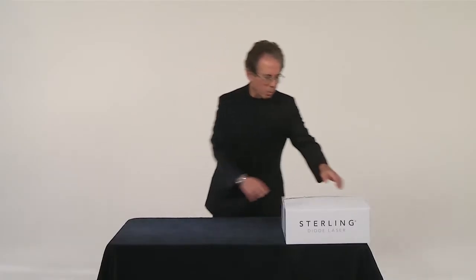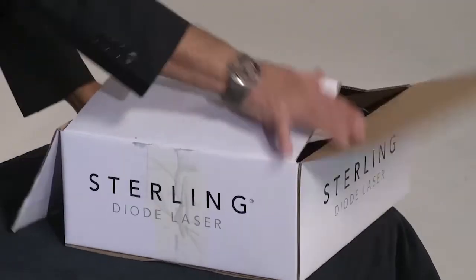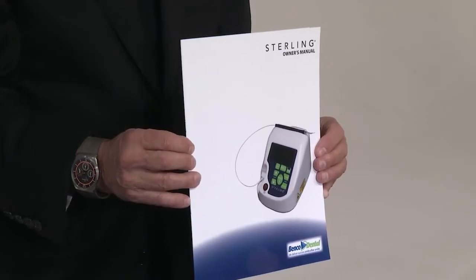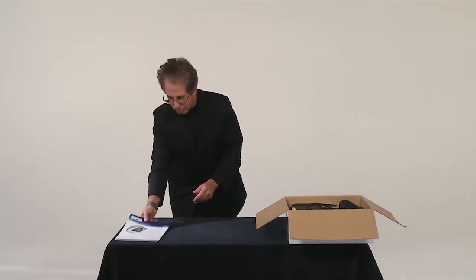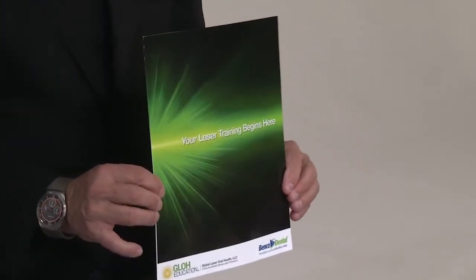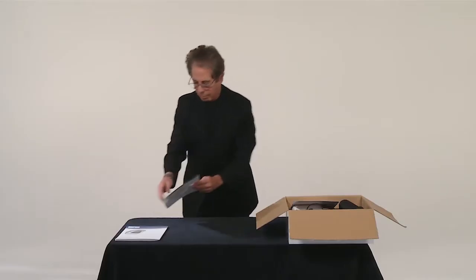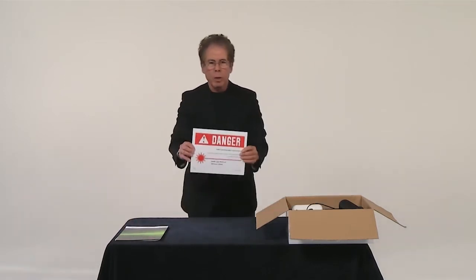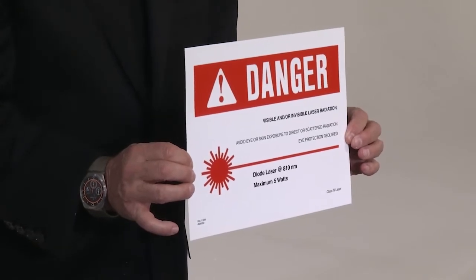Let's remove the contents of the laser box. First we find a laser training manual, which comes with all the lasers. Next we have a training component, and lastly we have a safety sign, which is necessary when utilizing a laser.